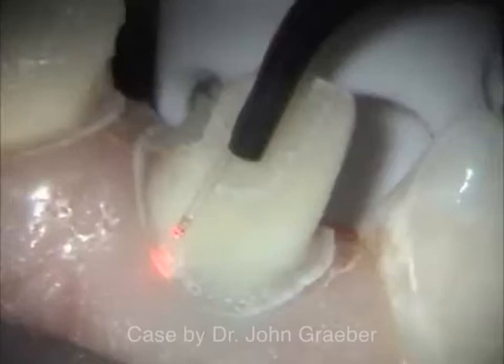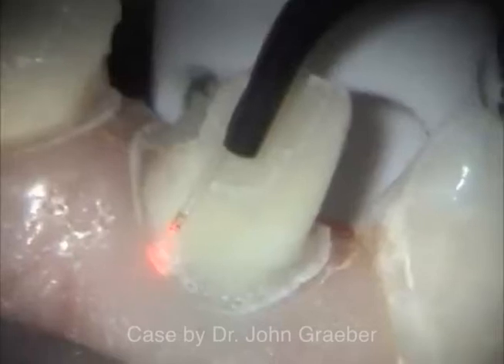In this case, both non-vital central incisors have been prepared without local anesthesia and have flush-to-the-gingival shoulder preparations for all-porcelain crowns.